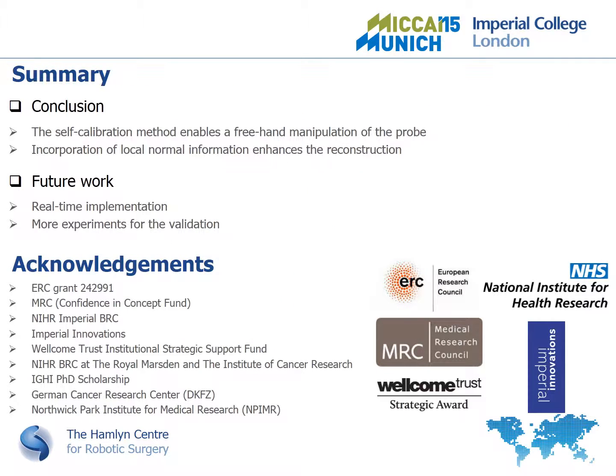In summary, based on the previous structuralized system, we developed algorithms to aid the reconstruction procedure to make it more practical and accurate. Our contribution mainly focuses on two aspects: the self-calibration method, which enables a freehand manipulation of the probe, and the incorporation of the local normal information, which enhances the reconstruction result. We are currently working on the real-time implementation of these algorithms, and more experiments will be carried out to validate the whole system.